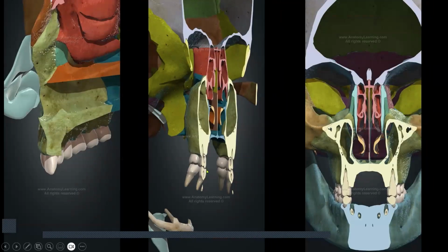Now, if we talk about the posterior region, behind the anterior wall of the sinus lining is the posterior wall of the sinus lining. That means there is a zone B where the sinus is present. Behind this posterior wall of the sinus lining is zone C, or the posterior region. In the maxillary posterior region, the bone we engage is the pterygoid bone. This is the posterior region where we engage the implant.